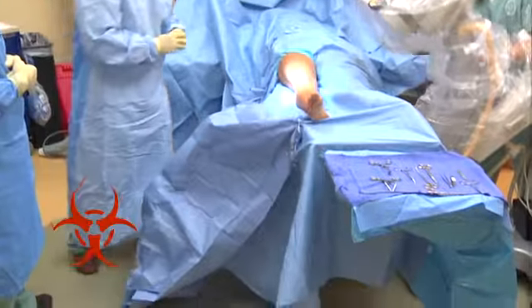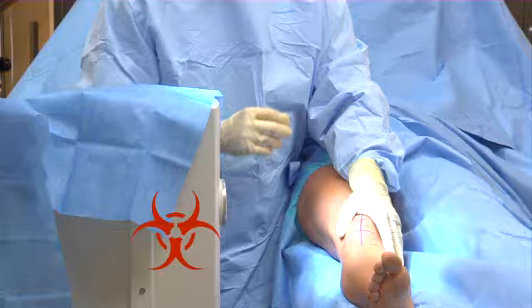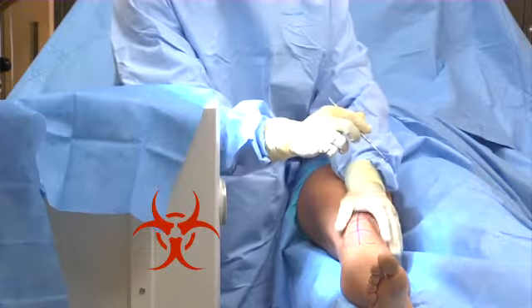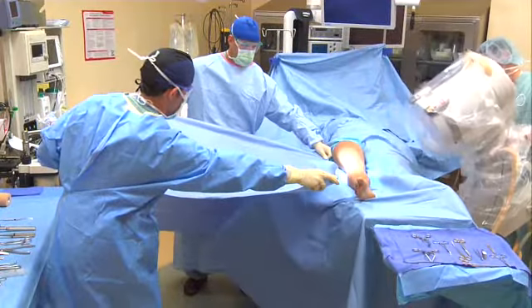Drapes fall below the sterile field line and are reused. Gaps occur in the sterile barrier. Surgeon and scrub technician contamination occur frequently. Focus is diverted away from the patient.